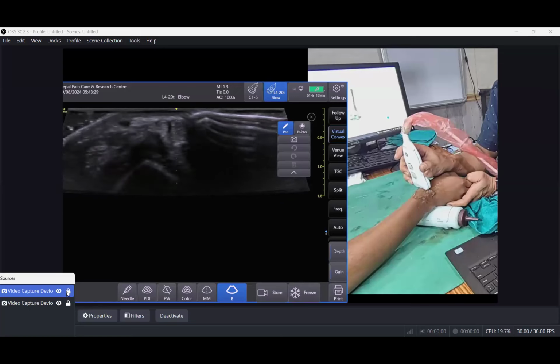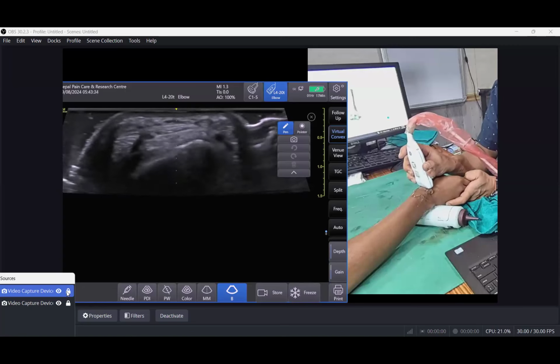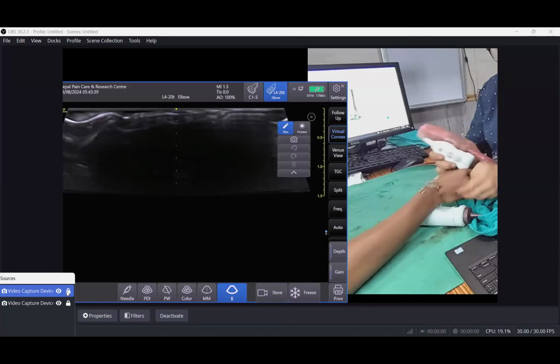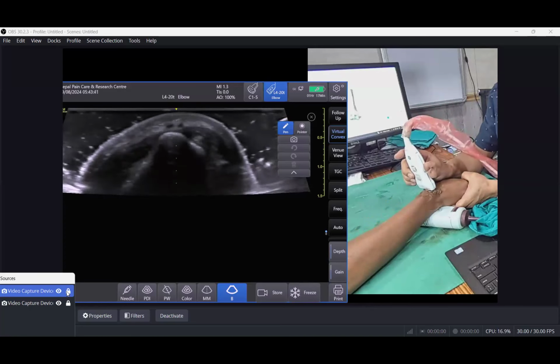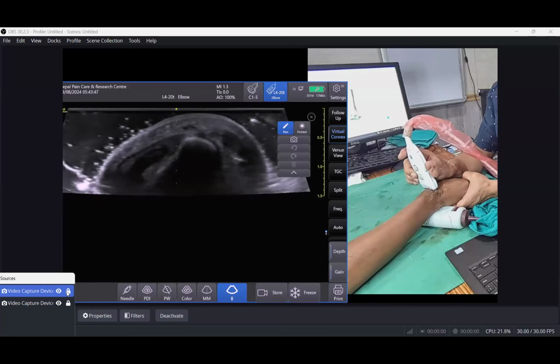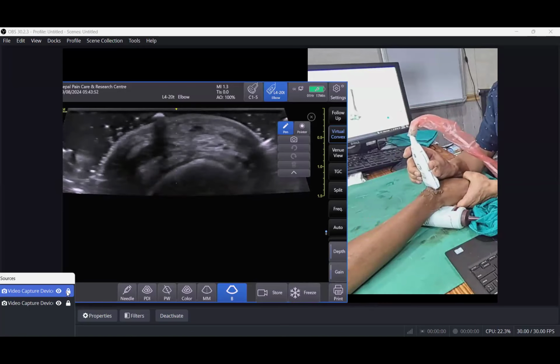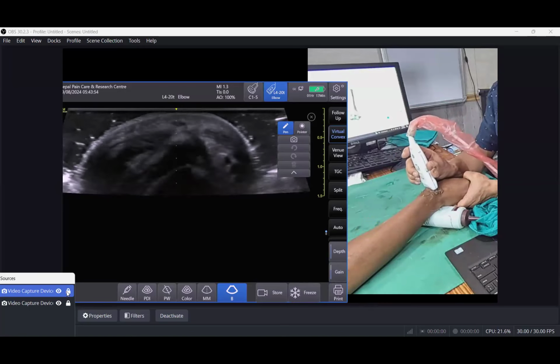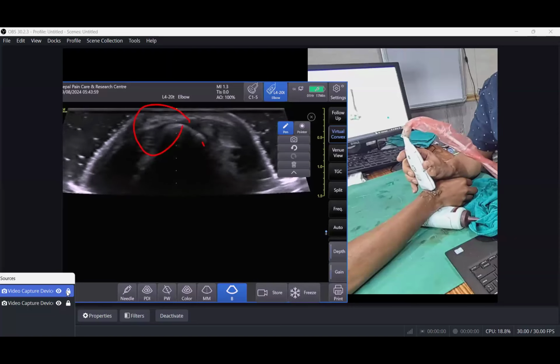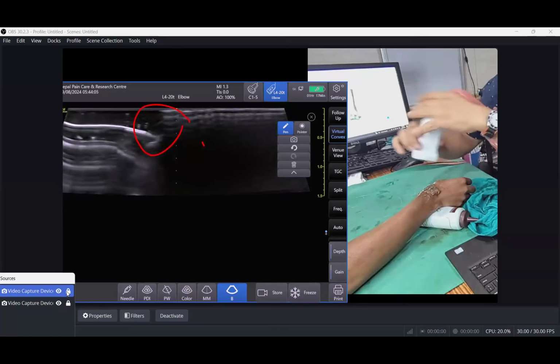So if I glide it like this in the center, look, okay? Here, lots of jelly is required. Now if I move my probe down, you can see the superficial radial nerve going below the vein and coming to the other side. Can you appreciate now? Yes, sir. That's one small structure. So if you focus around here, I'll try to show you.